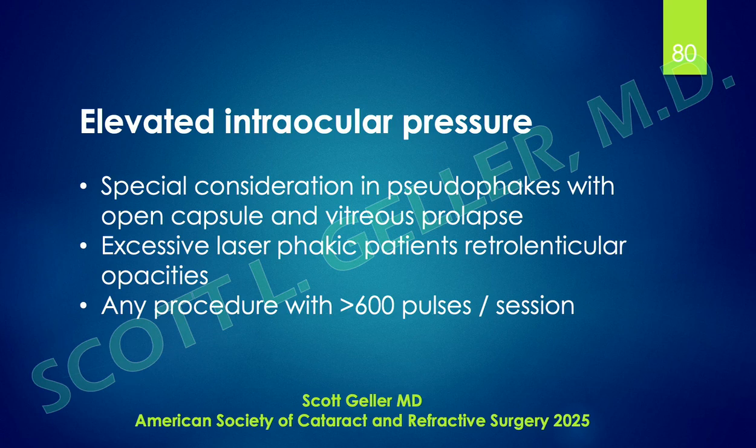Elevated pressure is from unknown causes. Nobody's been quite able to explain why, at least to me. There's been several theories, and I'll go over that in a minute. If you do excessive laser in phakic patients for retrolenticular opacities, phakic patients, you can get an elevation of intraocular pressure.